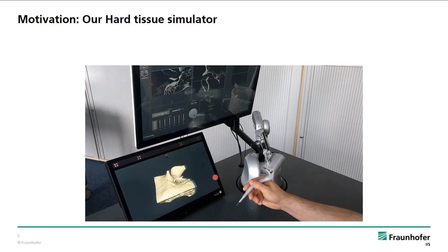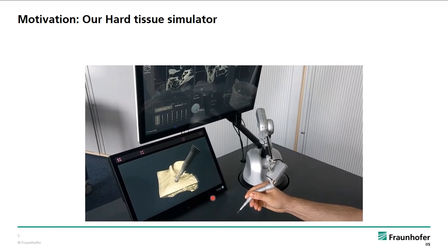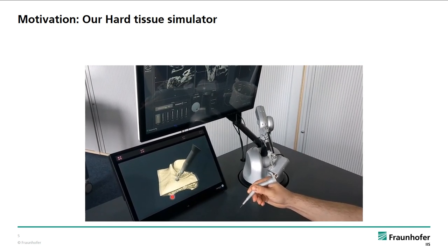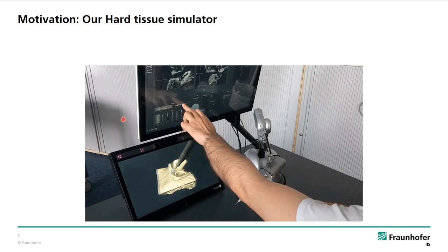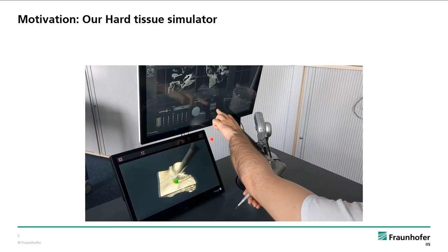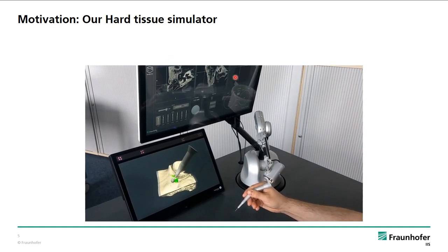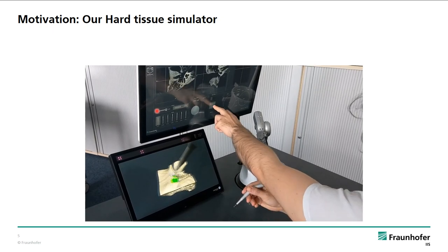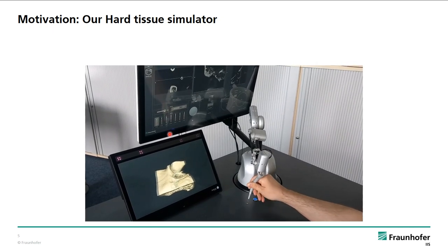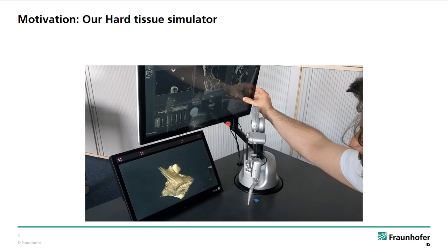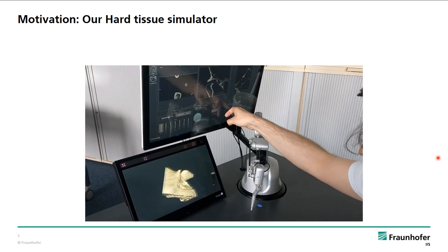Here you see our simulator with the Virtuose bone mill, and here you see the milling procedure. This is the autostereoscopic monitor, and this is a touch monitor showing the speed data and control of the different blades and different diameters of the mill. Here you can see the rotation and the moving of the bone.